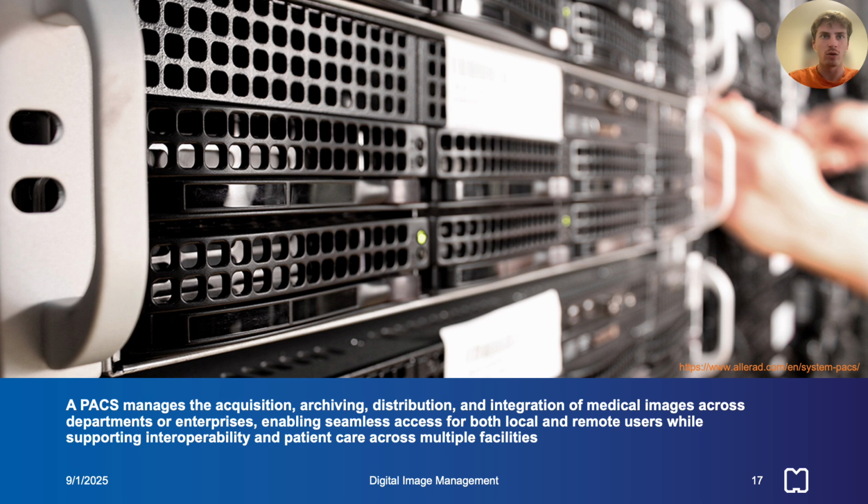PACS, or Picture Archiving Communication Systems, may be a small system that addresses the needs of one department, perhaps involving a single modality, with a modest number of workstations for a limited number of specialized users. More commonly, the term PACS refers to a system that serves an entire enterprise, such as a hospital or a large outpatient facility.